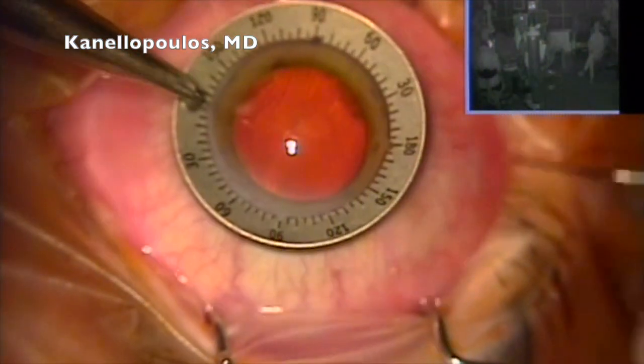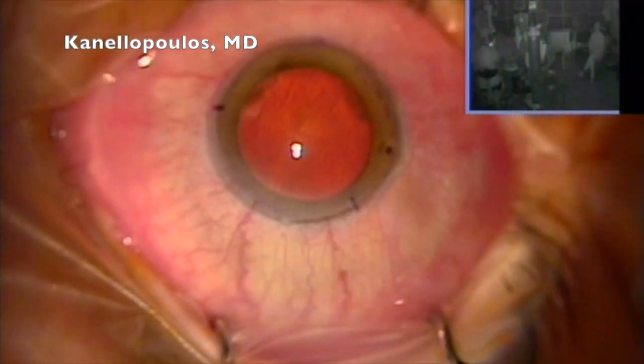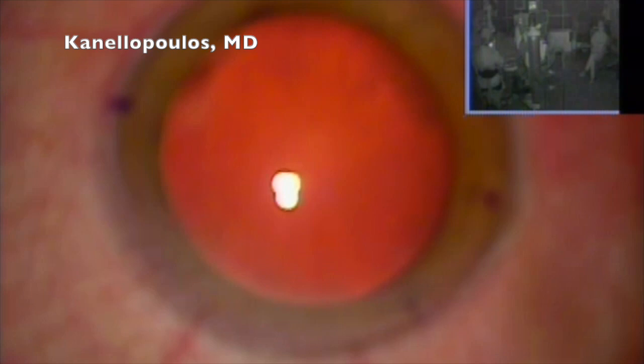Again, another case. These are consecutive cases. They're not selected. This is a T5 toric lens, so we're talking about 3 diopters of astigmatism.